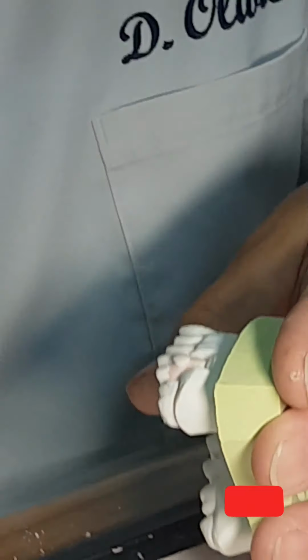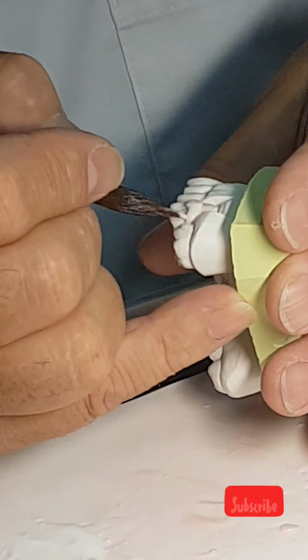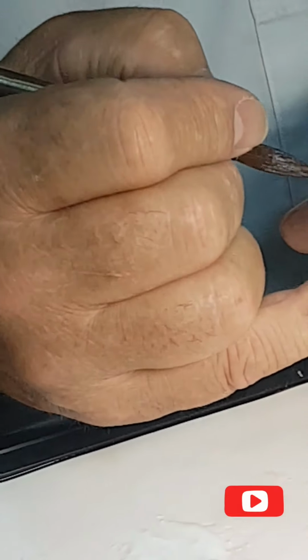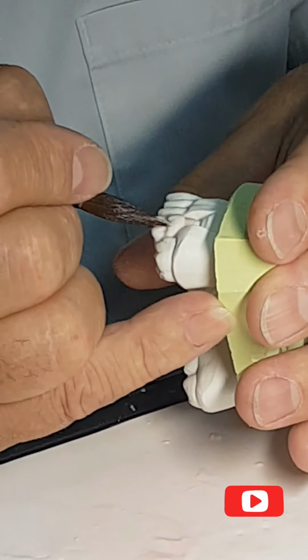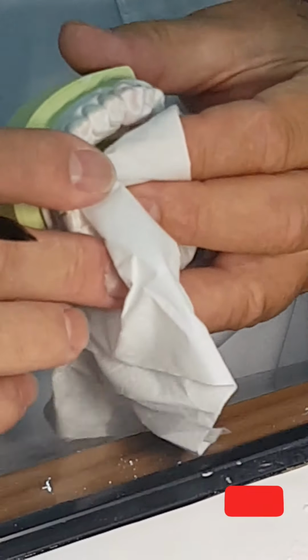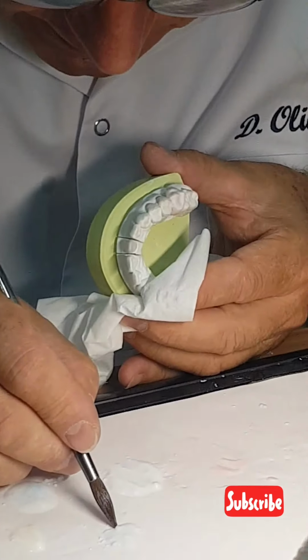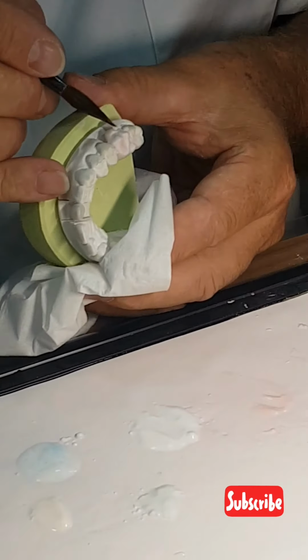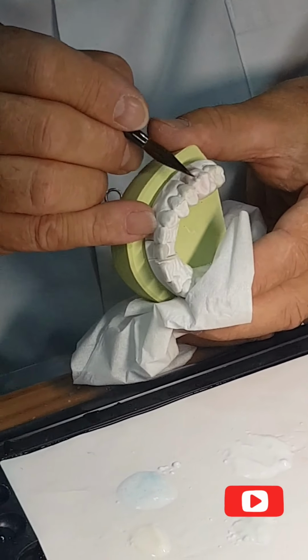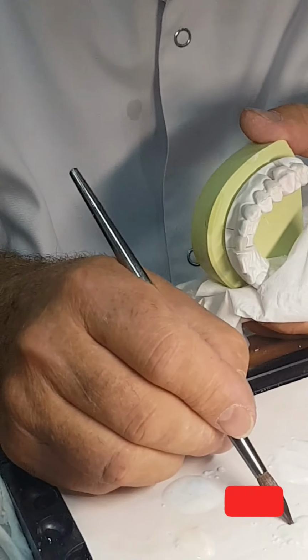To finish, I draw with cervical translucent at a good place. I draw the start of my crown. Here, CTA. And I continue. Enamel. So now it's time I talk about a whitish crest of enamel. Look, very simple. I overbuild 10% with white. Only the crest. Straight. Directly, it's enamel.